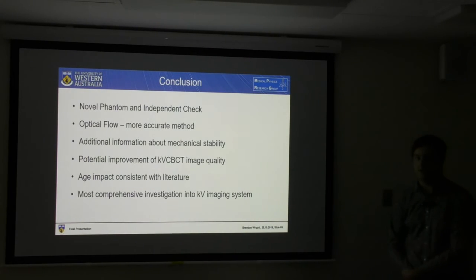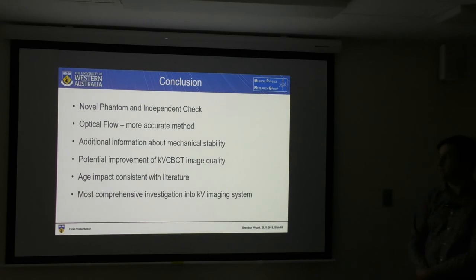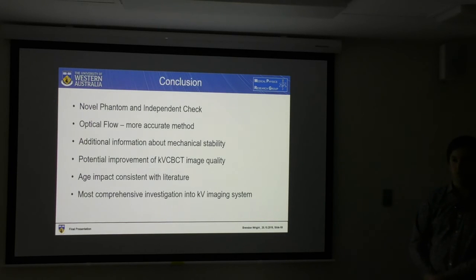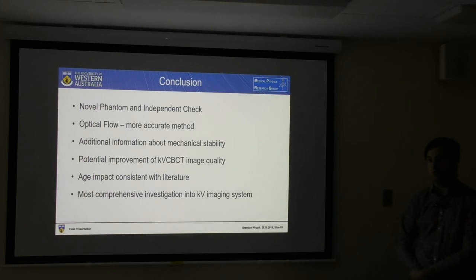So in conclusion, I was able to develop a novel phantom which provided an independent check in terms of mechanical stability, with optical flow being a more accurate method when compared to the Hough transform. Additional information about mechanical stability, in terms of not just imaging at cardinal angles but during full gantry rotation, allows for an in-depth prognosis as to the performance of machines, with the most accurate machine being recommended to be used for any sort of stereotactic treatments.